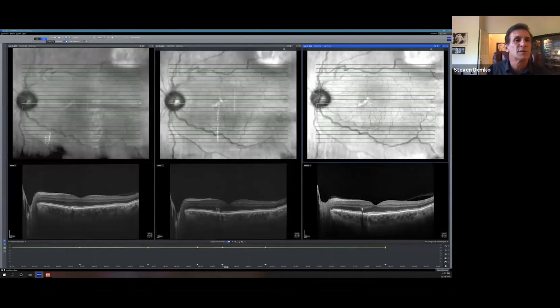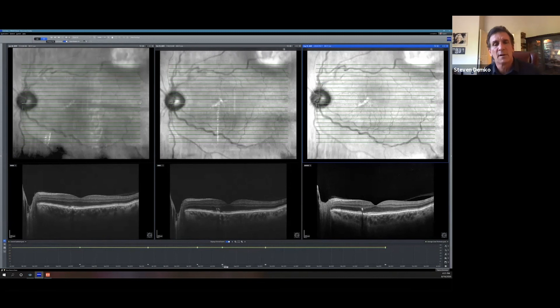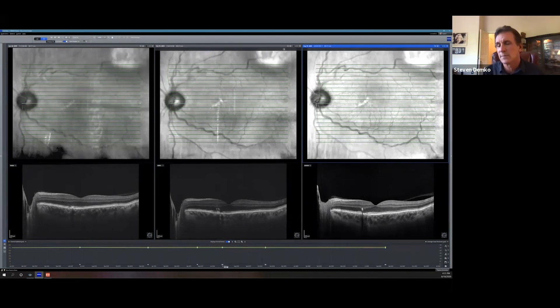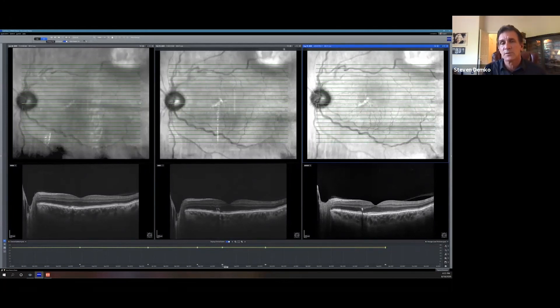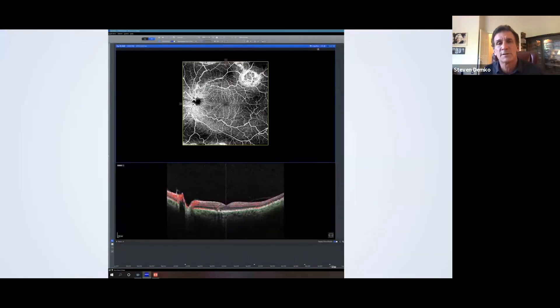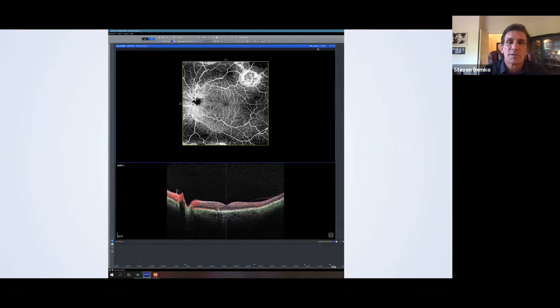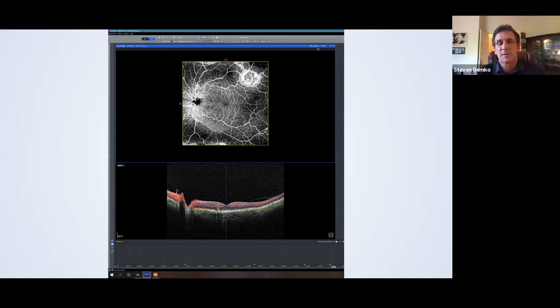And then I go over down to the 21 line raster. And then here's his images from the previous years compared to what we did the other day for him. And you could see that there's relatively small changes in the amount of drusen. There is changes in the ellipsoid zone, which is of some concern. And I'm wondering, well, I want to know if this needs treatment. Do I need to send them to a retinal specialist? Should I manage this myself? And here's his angiography. So clearly, there's some disruption. There's some changes. There is the start of a choroidal neovascular membrane. So he's going to get referred for a fluorescein angiography and treatment considerations.